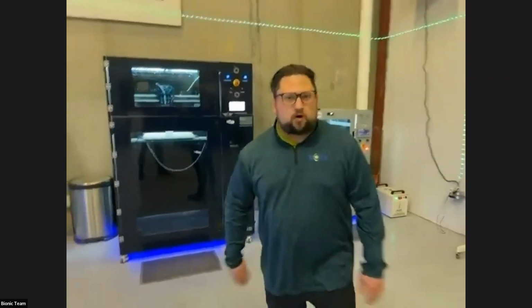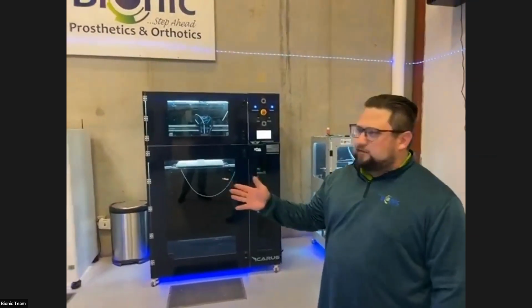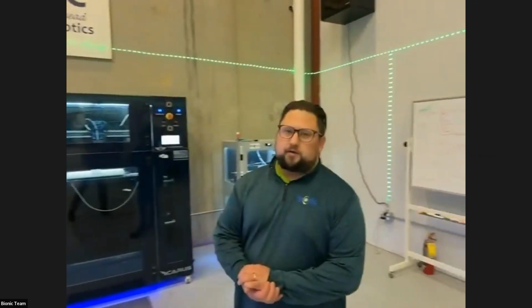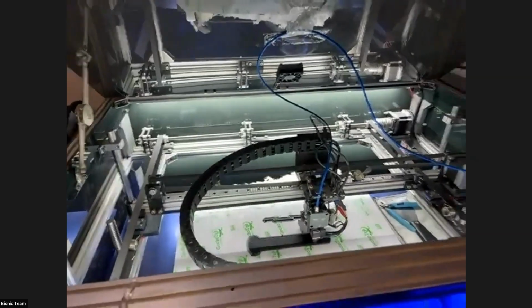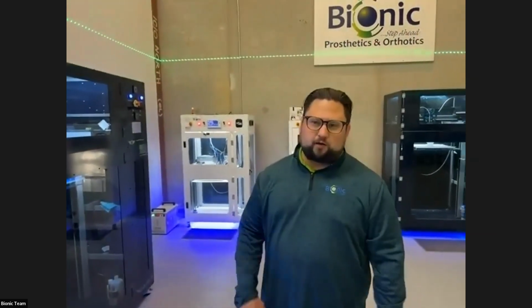Okay, so these are our toys. We have 5 different high flow printers and a standard flow printer. Now, the difference between standard flow and high flow: when we're printing with a standard flow printer, which we have going in right here, we can get a lot more detail. What it does is it prints an outer layer of a certain thickness, and then we have a honeycomb structure between it, and then there's an outer layer as well that solidifies the object.